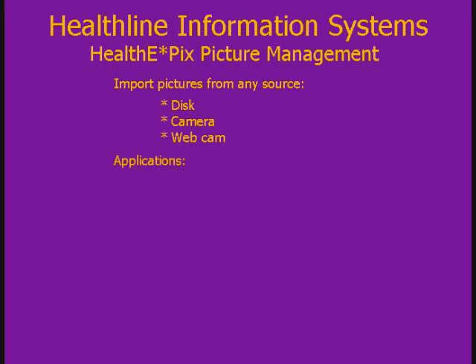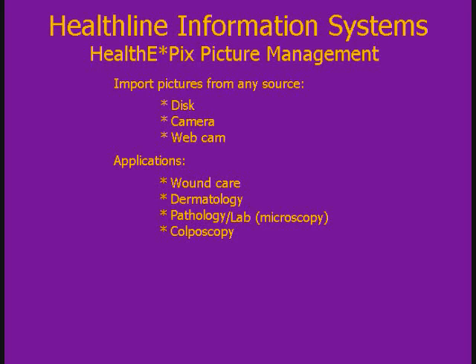HealthEPix is suitable for a range of applications. For wound care, wounds can be documented over multiple visits, then compared to track healing progress. Dermatology benefits for the same reason. Pathology, lab, or any application of microscopy can benefit hugely by documenting images of microscope slides for both reference and training purposes. Colposcope images are especially useful in the case of sexual assault victims.